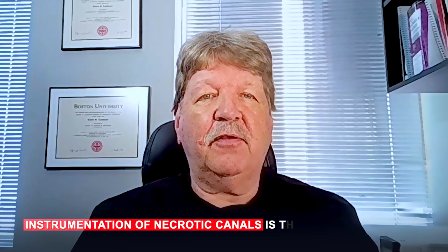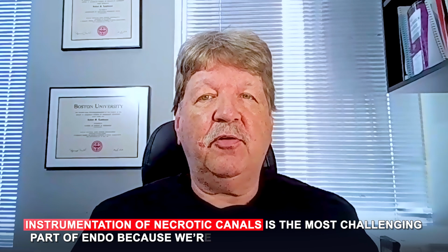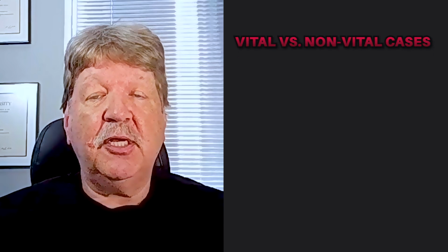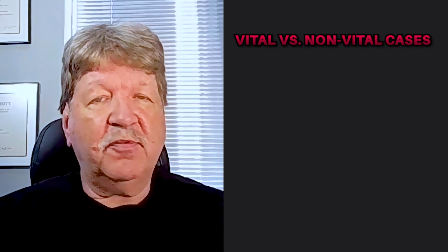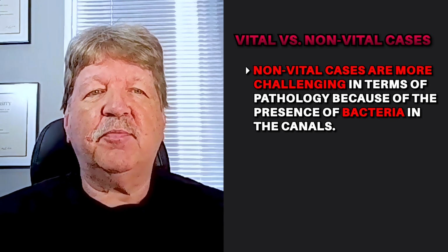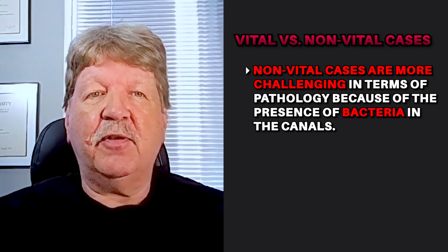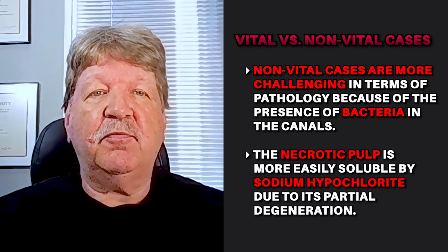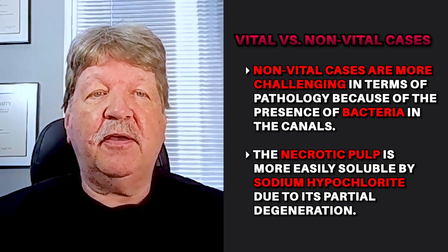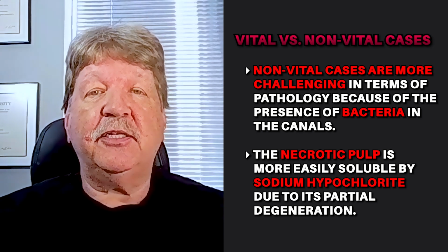Some clinicians think that instrumentation of necrotic canals is the most challenging part of endo because we're dealing with an infected canal. When endodontists are asked whether they prefer to treat vital versus non-vital cases, in terms of pathology, non-vital cases are obviously more challenging due to the presence of bacteria in the canals. However, the necrotic pulp is more easily soluble by sodium hypochlorite because the pulp is already partly degenerated.